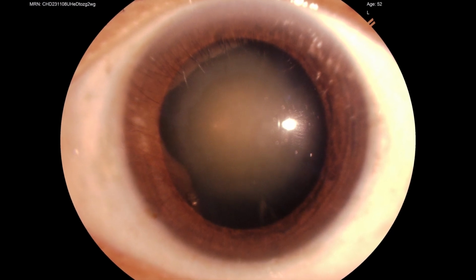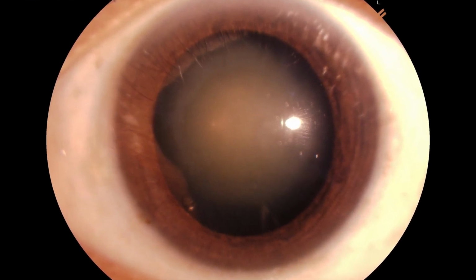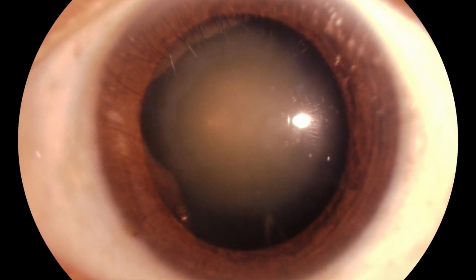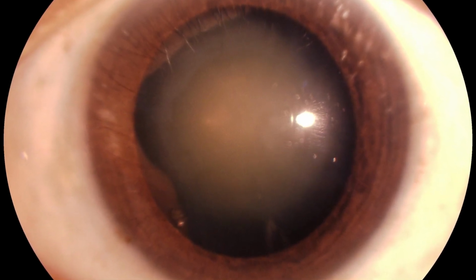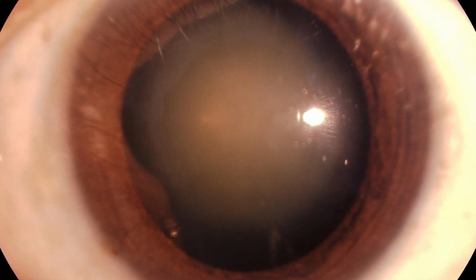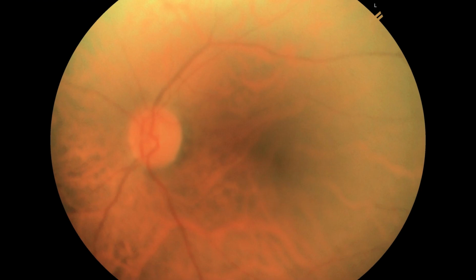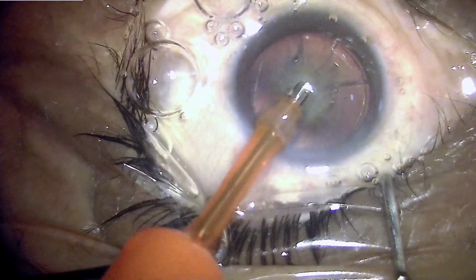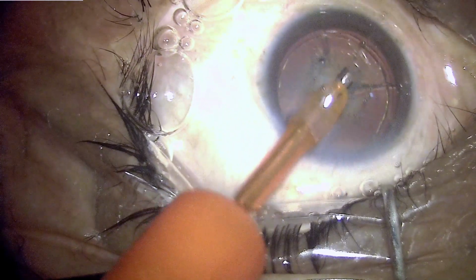This is one eventful video which we'll be sharing today, and this is the patient who was a female patient and had a significant cataract and was planned for surgery.